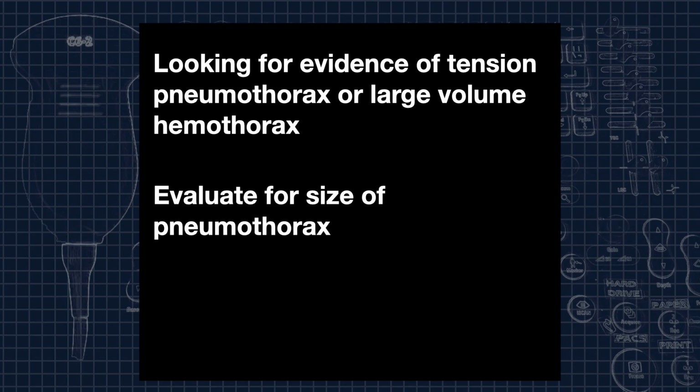We still have to interpret this somewhat clinically, right? If we see a pneumo, we can't always assume that, hey, this is tension physiology. Maybe we have to in a certain clinical scenario, but we may find things, and we have to continue to look and see if there are other things that we may also want to find, right?